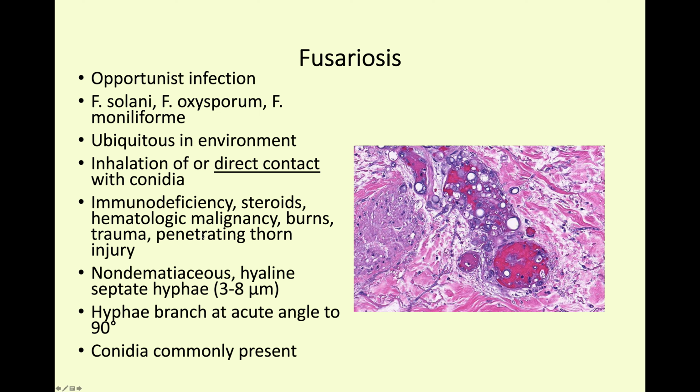And as I've mentioned, the hyphae branch at anything from an acute angle to 90 degrees. And this Fusariosis is one of the fungi in which conidia are particularly present, as was dramatically shown in this case.